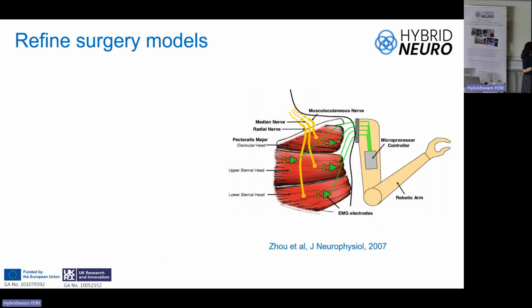So you have here a subject with an amputation that is very proximal, at the shoulder level. So there is no arm left, and when you have a prosthesis, in this case, you need to be able to open and close the end of the prosthesis, to rotate, and also to flex and extend the elbow. So what you should be able to perform with the prosthesis are three functions. But you don't have many muscles left. There is the pectoralis available that you normally use to control the shoulder, but the shoulder is no longer available, right? So you won't be using this muscle.